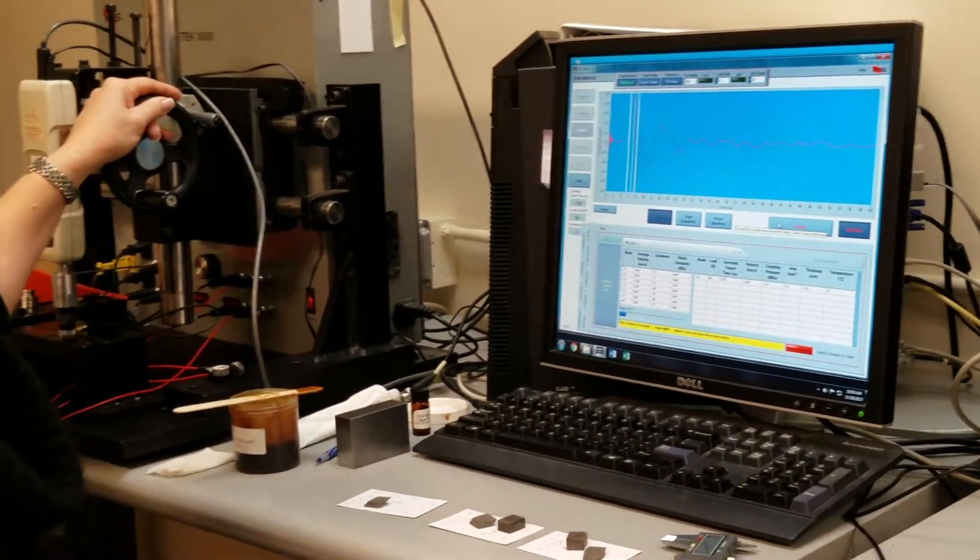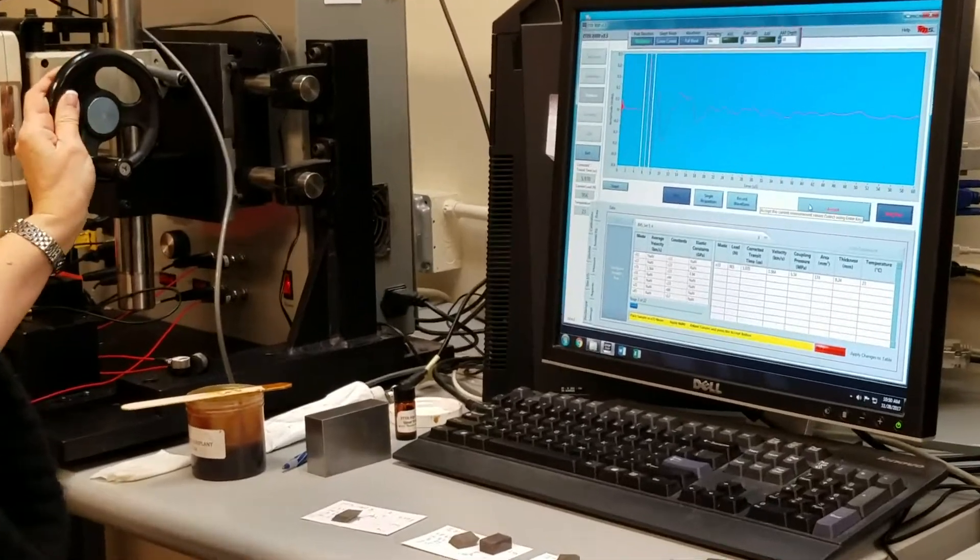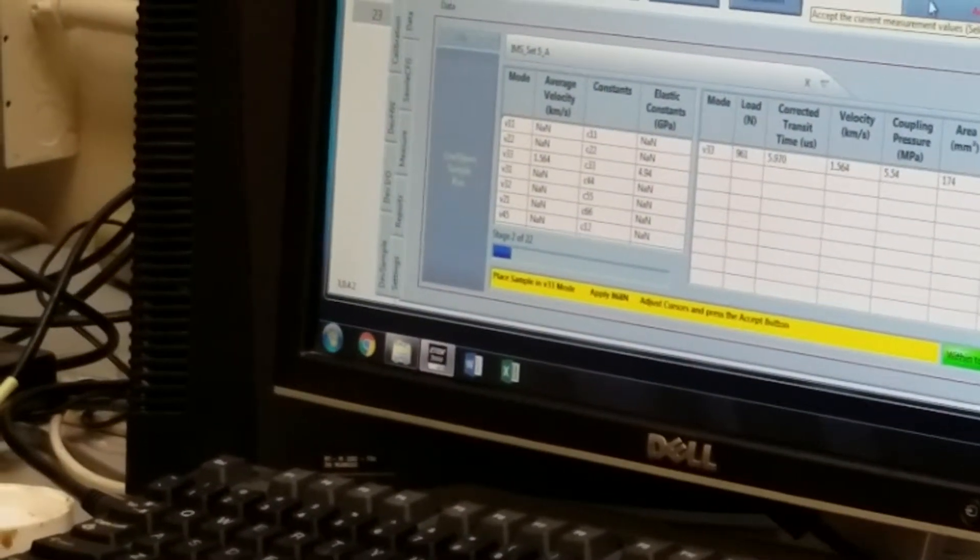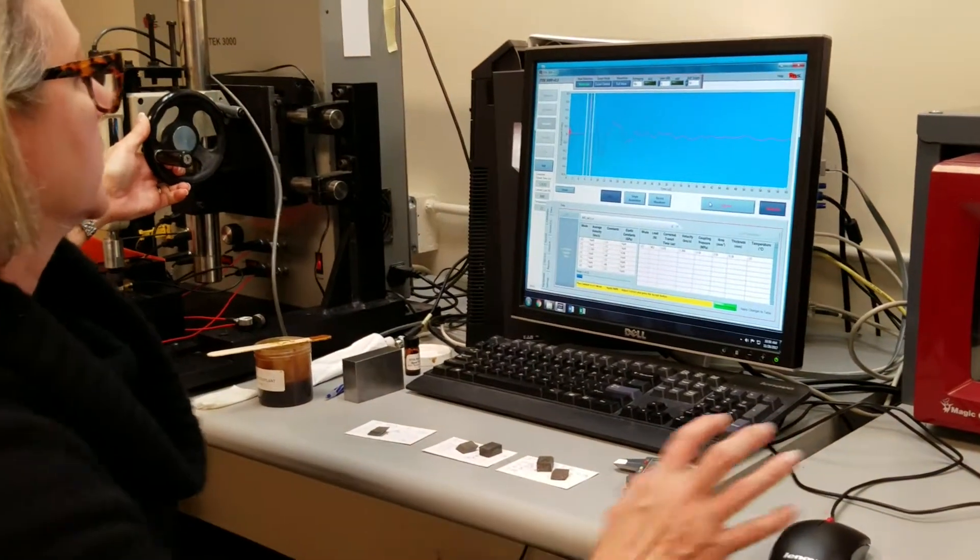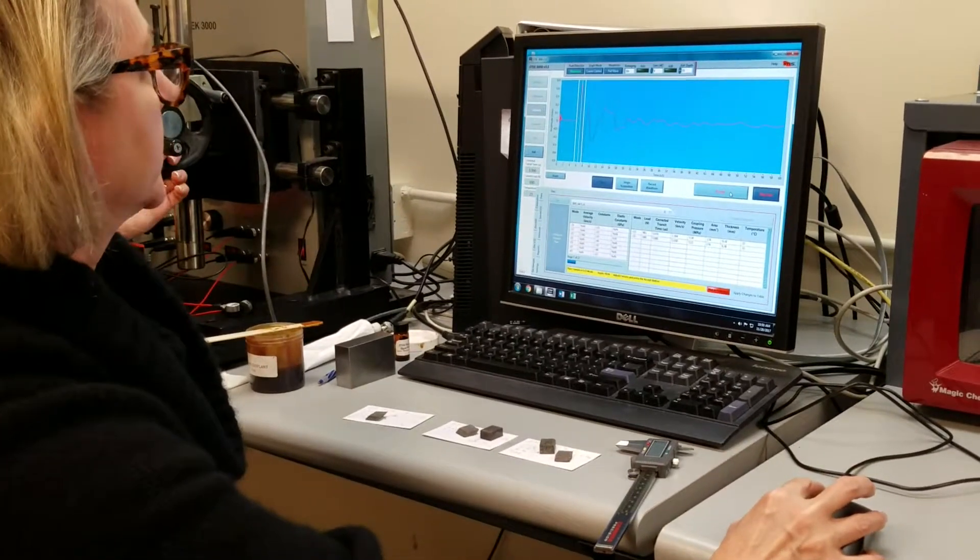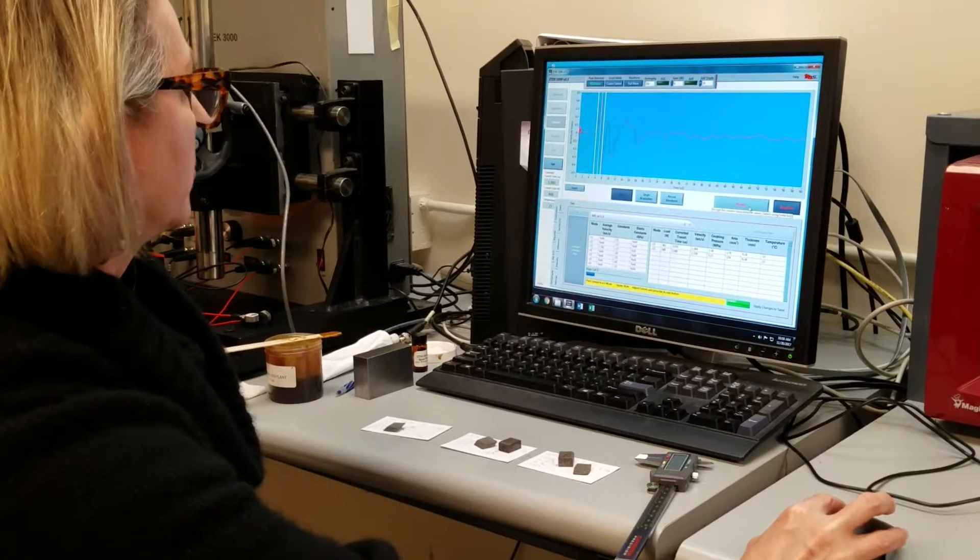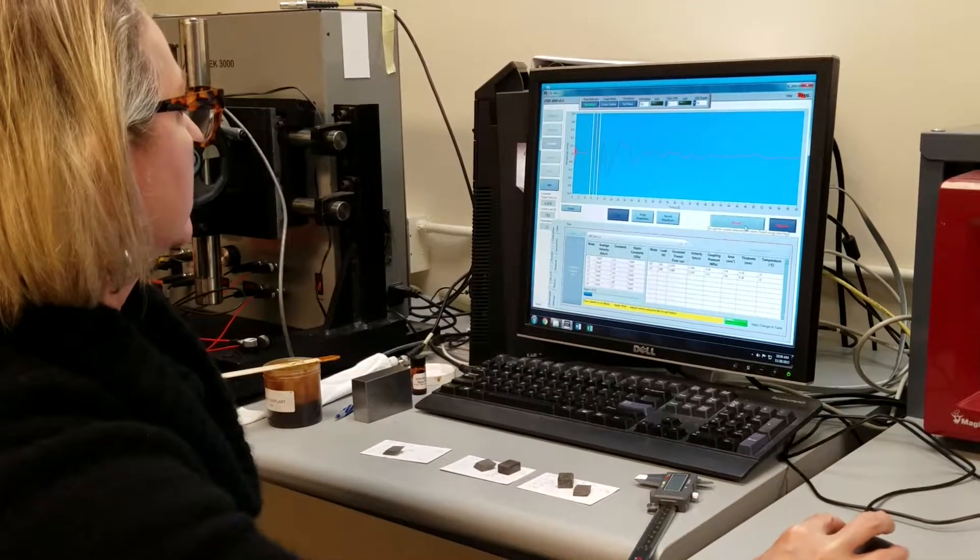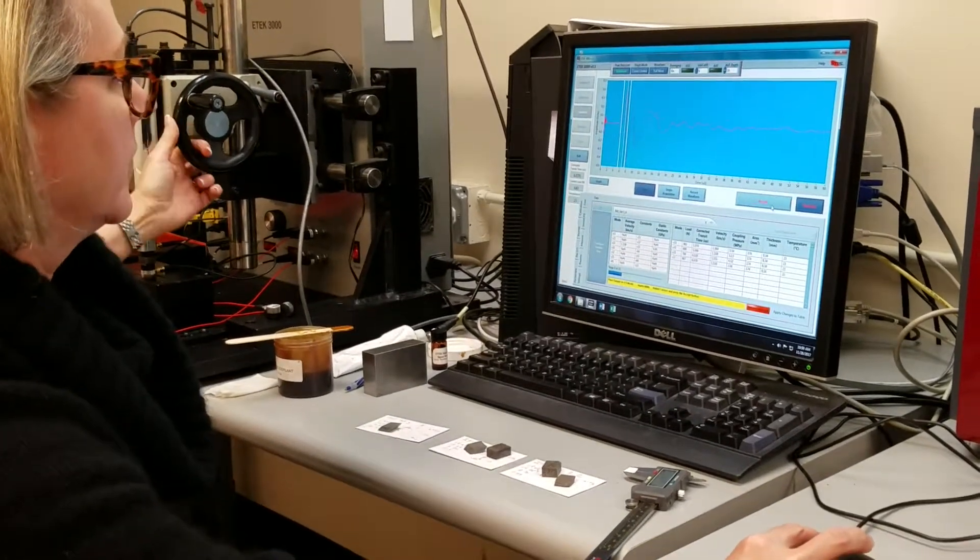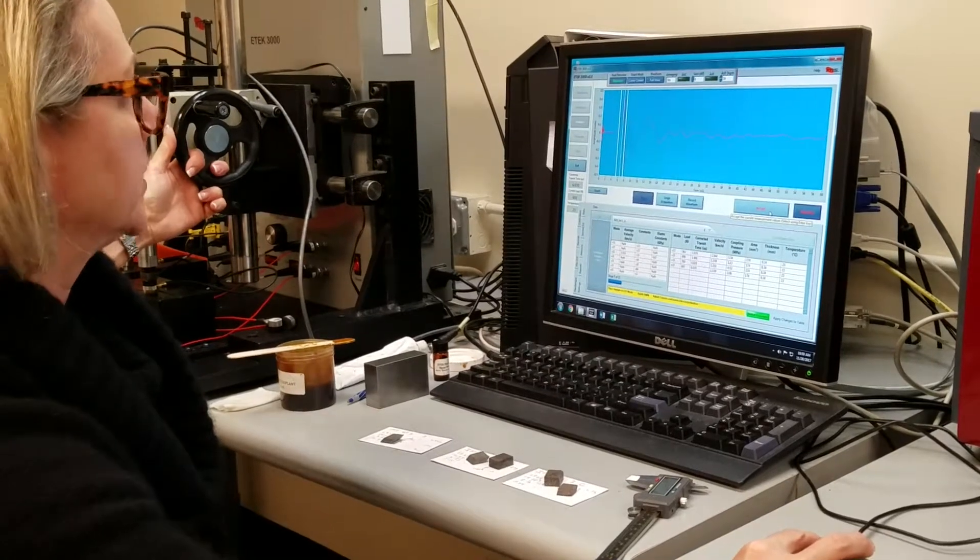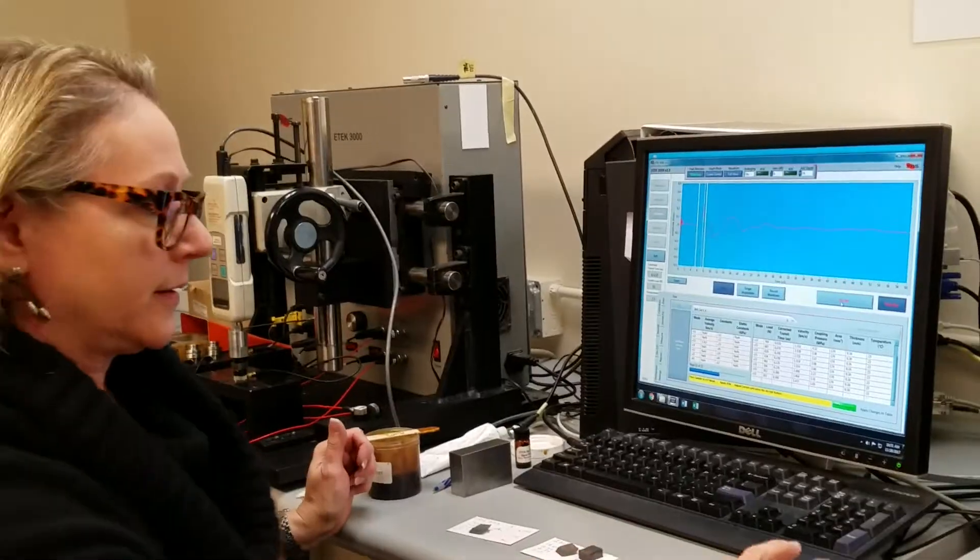Now, the prompt at the bottom of the screen says apply 868 newtons, so I simply start to release the load until we're at approximately 868 newtons. And once I'm there, again, I click accept. And I will be going now to 781, 694, and so on and so forth until I get down to about 89 newtons.